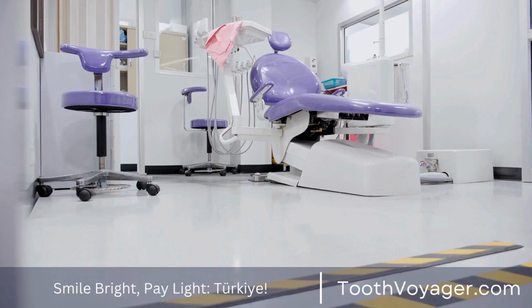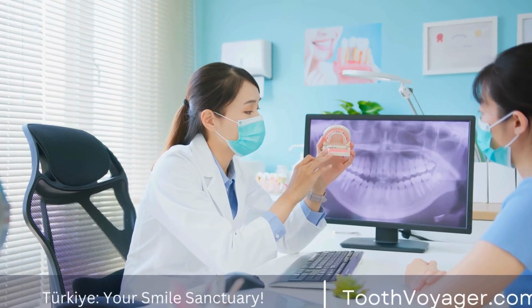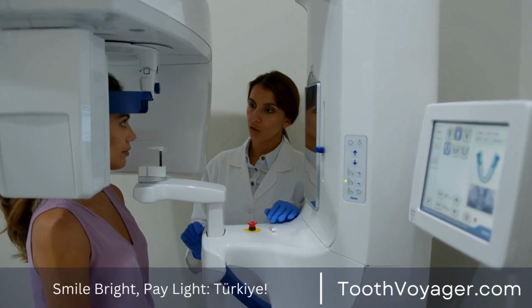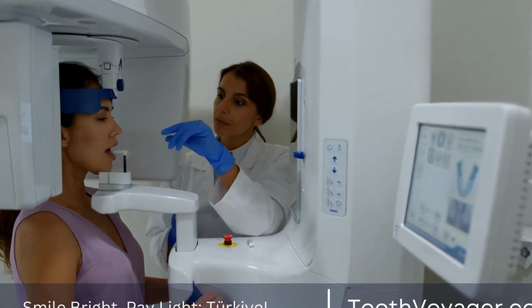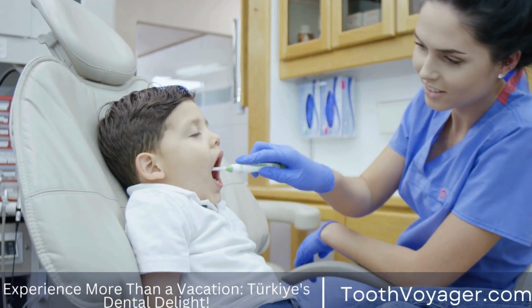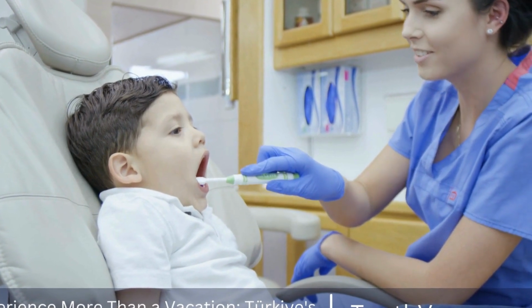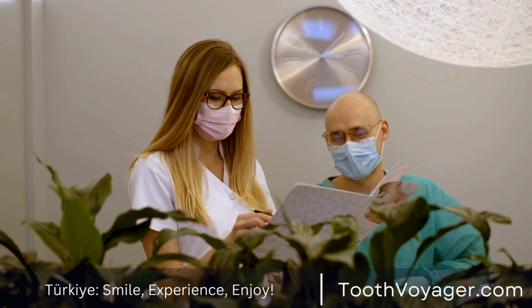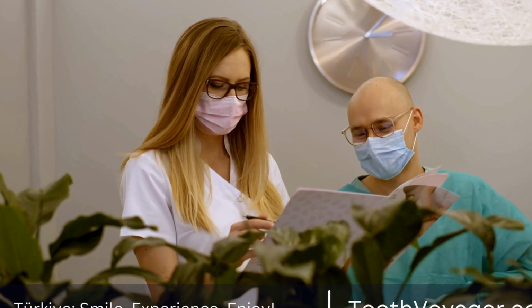3. All-on-4 implants. All-on-4 implants are a special kind of dental implant that can be used to substitute the entire arch of teeth. The procedure involves putting 4 implants at strategic places within the jawbone to provide an entire arch of synthetic teeth. All-on-4 implants are great for those who lost several teeth or have severe damage to their teeth and require an option that is more durable as opposed to traditional dentures. This type of implant can also be a viable alternative for those with inadequate bone mass to support each implant.